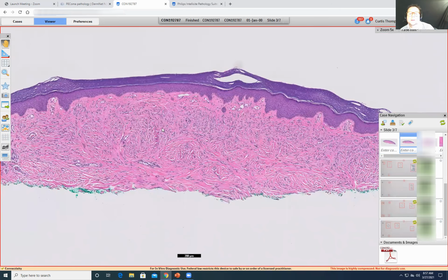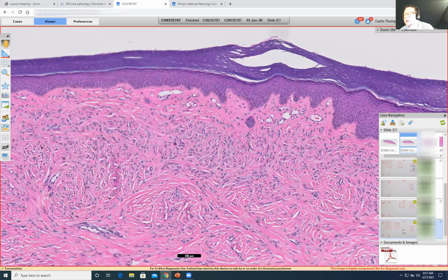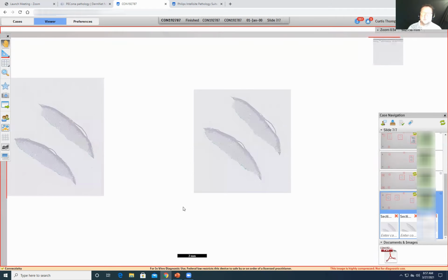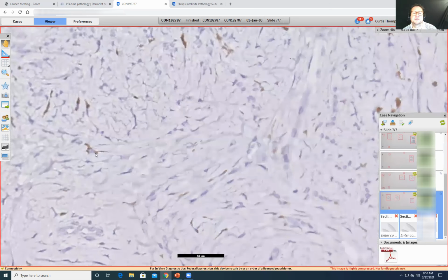This is a blue nevus, and I'm not going to show you a melanocytic marker. I'm just going to tell you it's a blue nevus. But we do use PRAME a lot now. This antibody is one of the first that's been useful for telling whether something's benign or malignant. Of course, like most antibodies, it's not 100%.